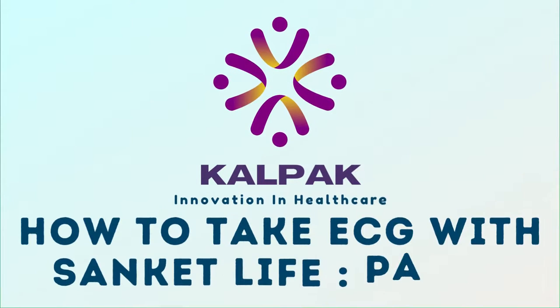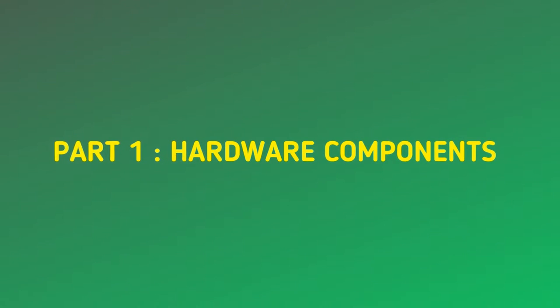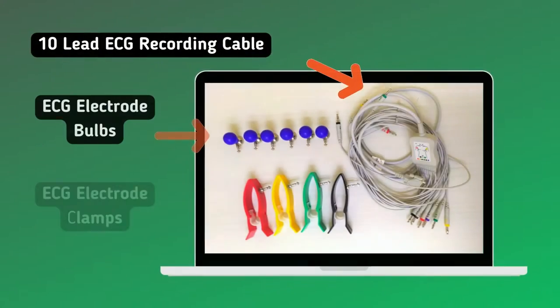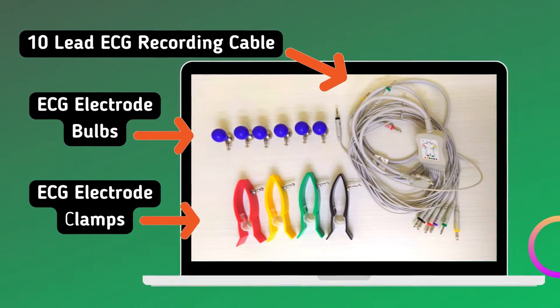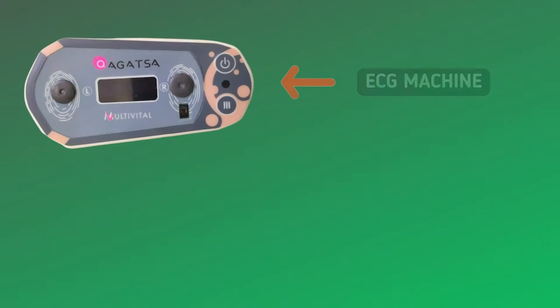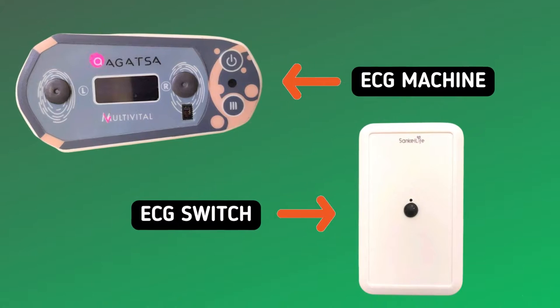How to take ECG with Sanket Life, Part 1. Part 1, Hardware Components. These are 10 lead ECG recording cable, ECG electrode bulbs, ECG electrode clamps. Sanket Life ECG machine and ECG switch.